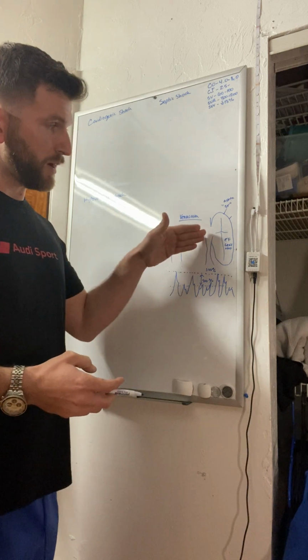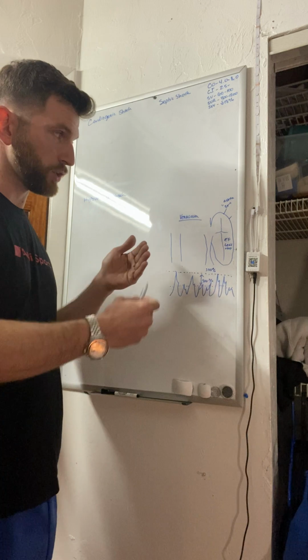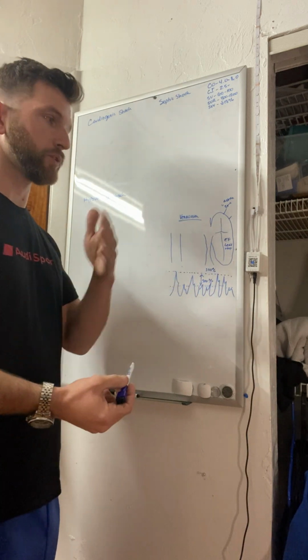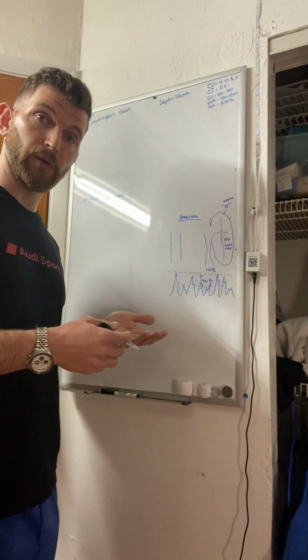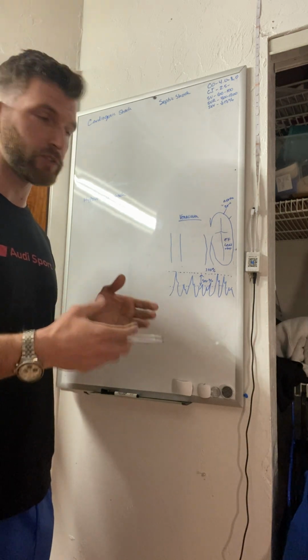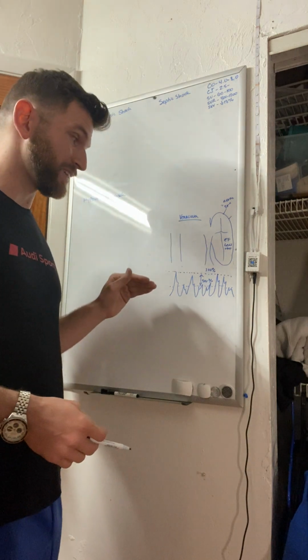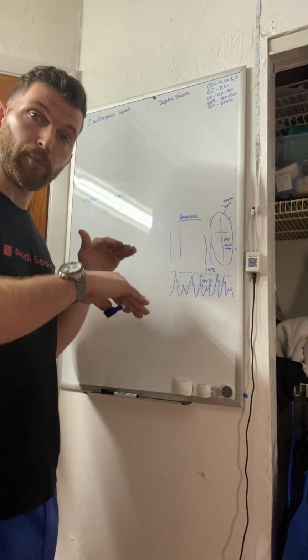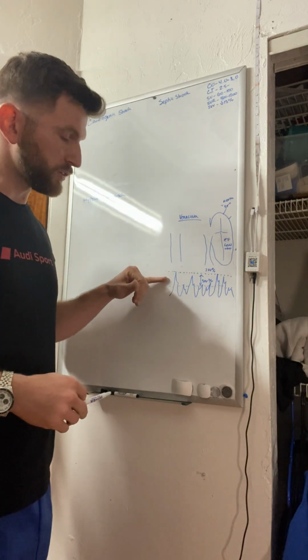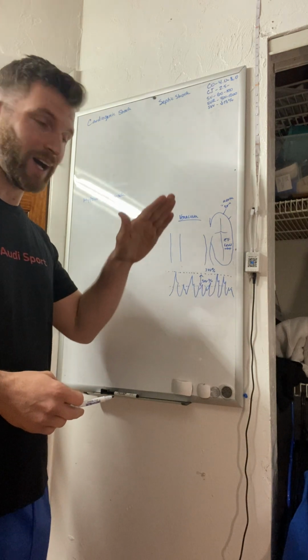It's going to reduce the amount of blood volume that can get to the right heart, so reduce your preload, which in turn reduces your afterload, which in turn reduces your blood pressure. So that could be somebody who has a low fluid volume in their system. This can be seen on an arterial waveform as stroke volume variation. Usually you see it with breathing, right? This is somebody on a ventilator. Every time you see a breath, you'll see a little bit of change in the height.